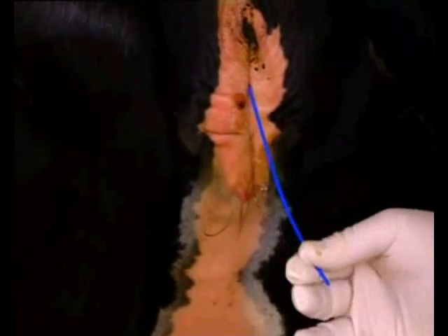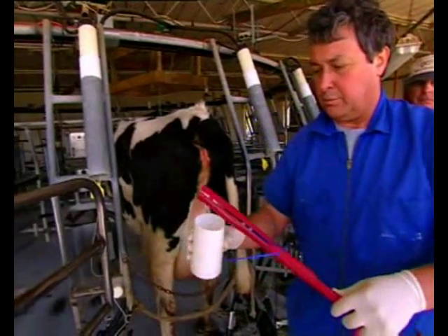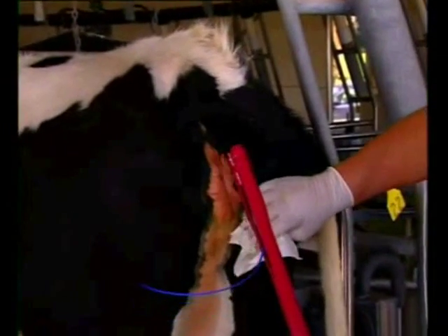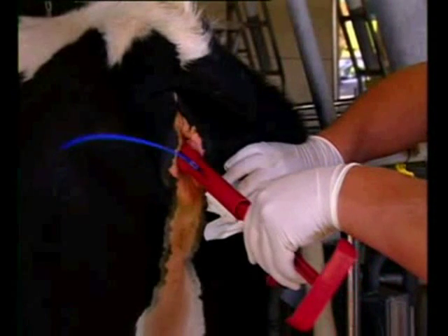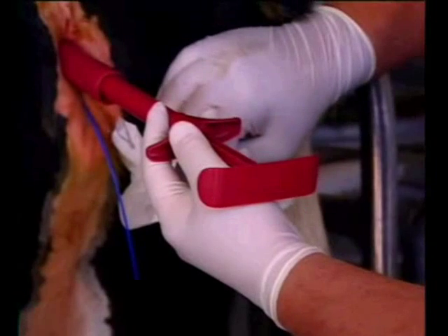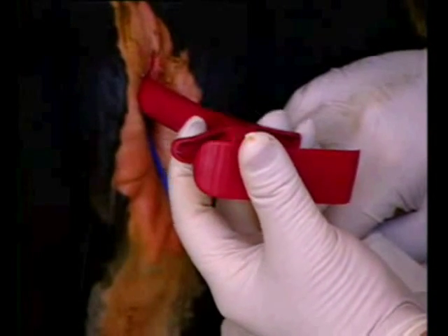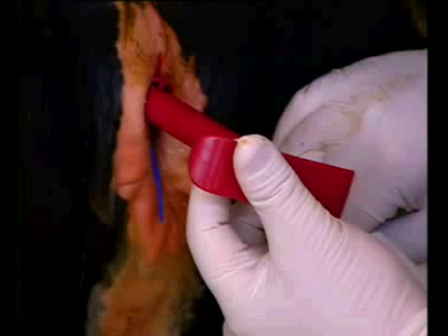Ensure the tail is protruding as shown. To recap insertion: apply veterinary lubricant, wipe the vulva clean, insert the applicator through the vulva lips in a forward upward direction and guide it into the anterior vagina. Turn the applicator so the Q-mate is in the horizontal position. Ensure the applicator is well forward in the anterior vagina up to the cervix. Release the Q-mate from the applicator by pulling the fingers towards the palm, so that the Q-mate is placed well forward. Do not withdraw the applicator until the device is fully released.